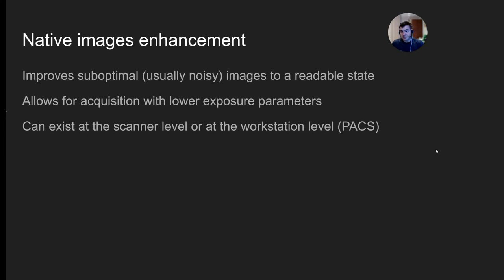And the last thing that I wanted to mention on this topic is that you can do this at the scanner level, or you can do it at the workstation level, so at the level of PACS. And both are used. Sometimes you would use both. At the scanner level, this is more of embedded various reconstructions. All sorts of reconstructions exist, whether you are minimizing the effects of metal in case of CT scanning, or whether you're trying to improve the image quality with low dose used. Most vendors would have one or another approach towards using that type of artificial intelligence through those avenues.